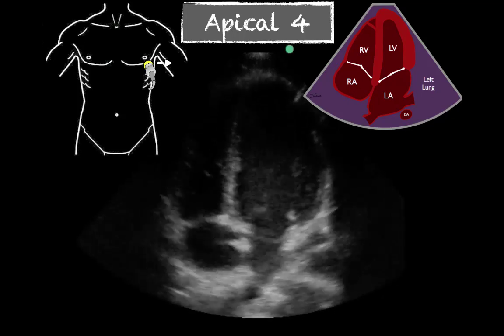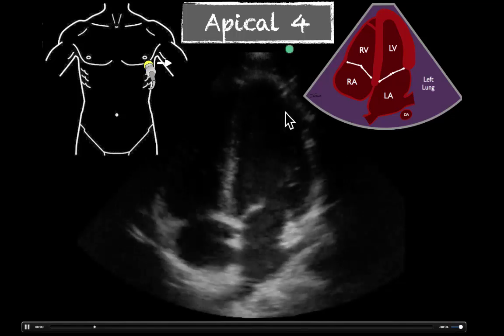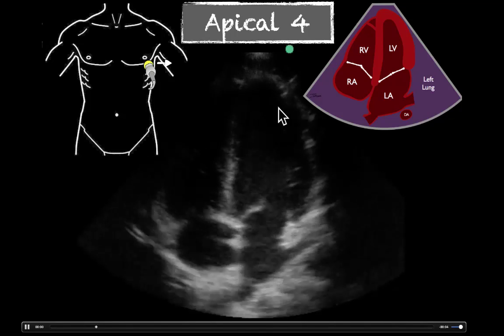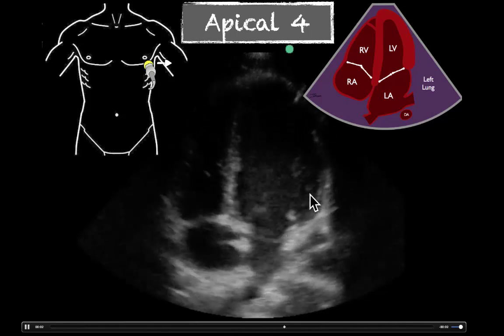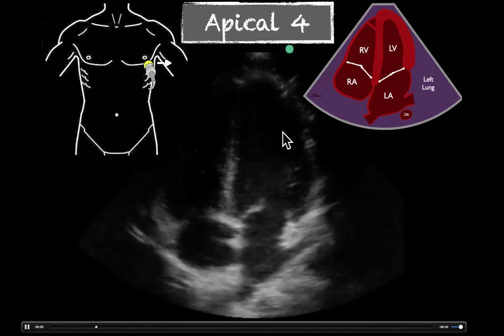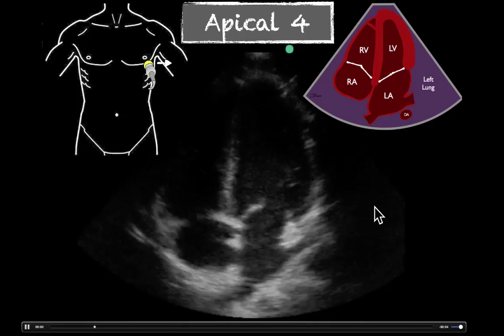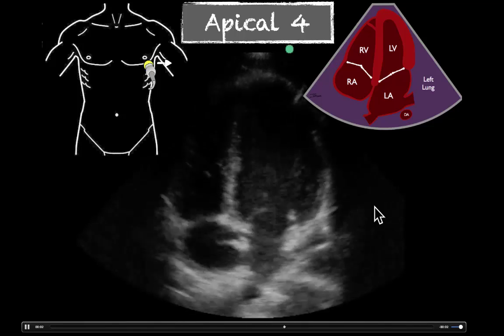We're going to see another example. Our gain could be a little bit better up here, but we can see this inner wall and that there's good collapse — all of it's coming together well. We can again see the mitral valve moving well. So this also shows a normal ejection fraction.